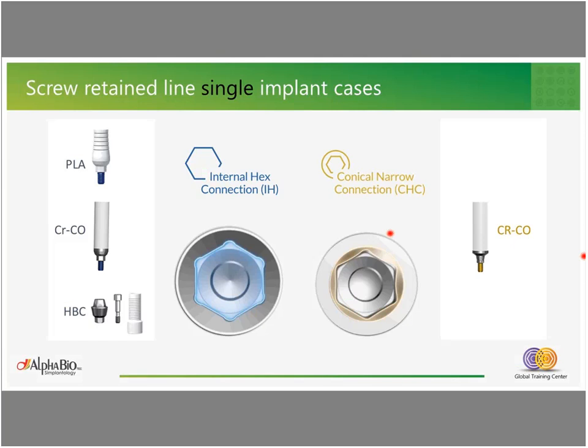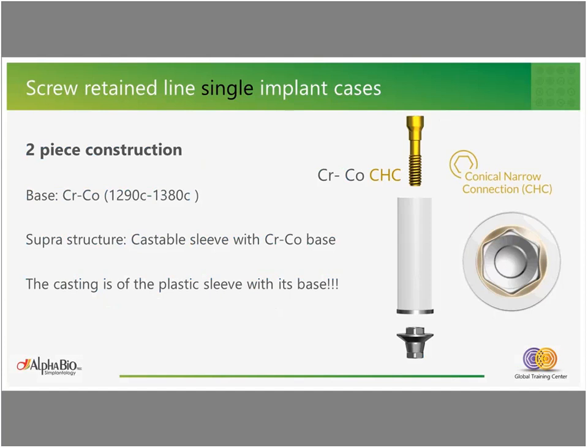And we can see that when we use the castable abutment on the implants, we can use this technique of two pieces of abutments. This part will be modified by wax and then casted. We have the base that will be connected to the implant, and one screw that will connect the two pieces together. This will ensure good accuracy between the parts, because we have a milled base on the implants, and we have the castable element that can be converted to the crown as the final framework of the restoration. This can be used mainly for the metal frame or chrome cobalt restorations.